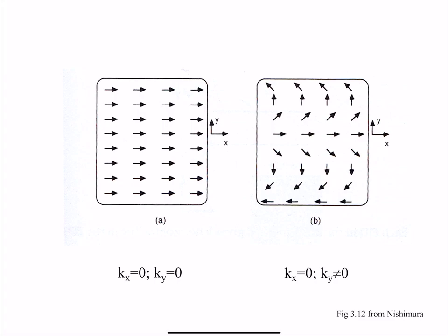We apply a gradient, and then at every point in time we hopefully have imposed upon the spins some spatially varying pattern, where the orientation of the phases of those spins, if we look at it closely, tells us where we are in k-space. So every point in k-space corresponds to some spatial arrangement of those spins, in a way that follows that complex exponential.